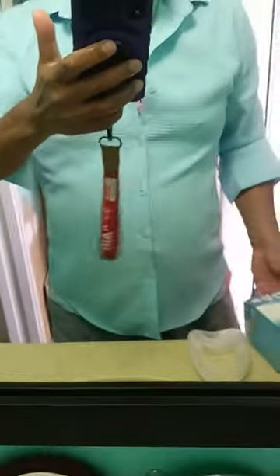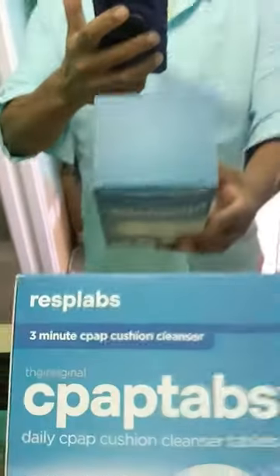Let me see the pipe. Yeah, it works pretty good. You get 96 of these, and it says it's a 3-minute CPAP Cushion Cleaner. I use it a little bit longer than 3 minutes.